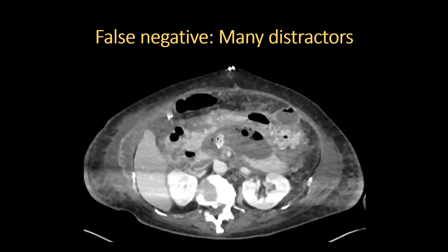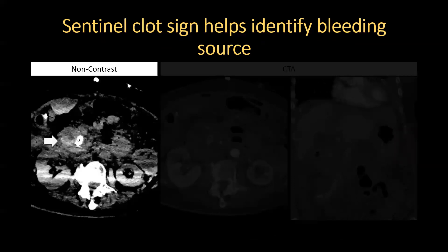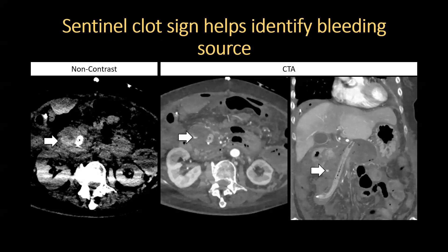Similarly, this next case was challenging due to many abdominal wall and intraperitoneal fluid collections in a 75-year-old woman with necrotizing pancreatitis and bloody drain output. The clinical history tells you where to look — around the drain. The sentinel clot sign can also help narrow your search; the sentinel clot is focal high attenuation clotted blood that provides a clue to the hemorrhage source. On the non-contrast image, we see sentinel clot around the drain, emphasized on liver windows. Axial and coronal CTA images show a focus of contrast extravasation within walled-off necrosis.